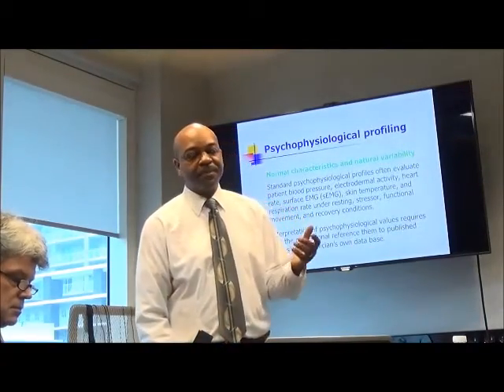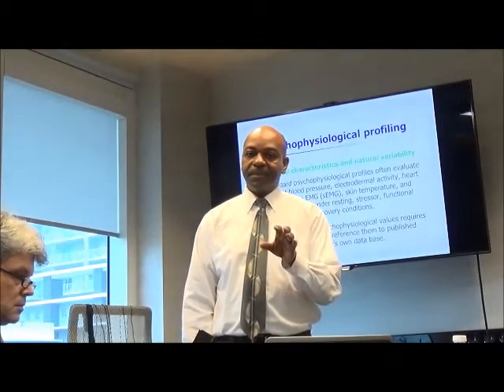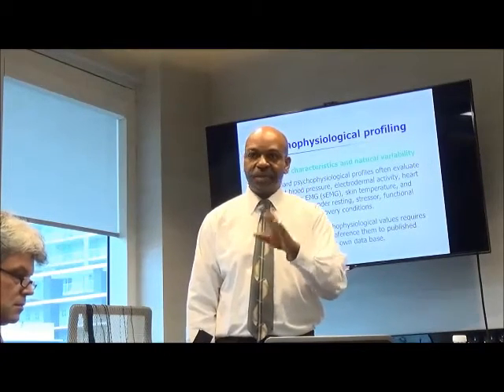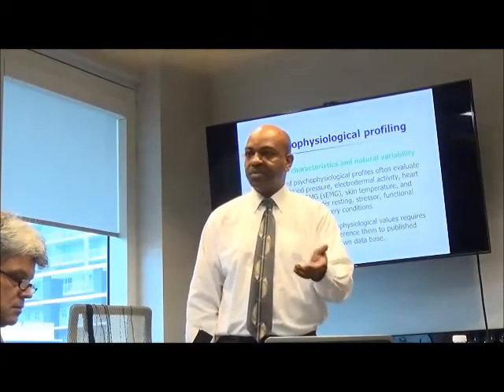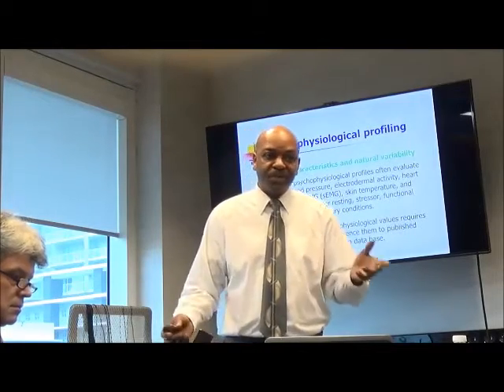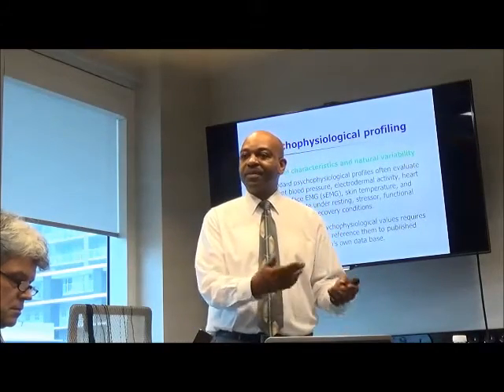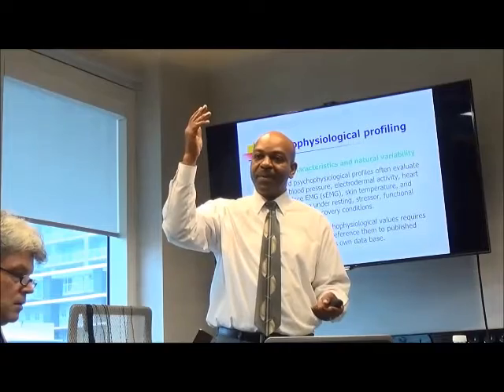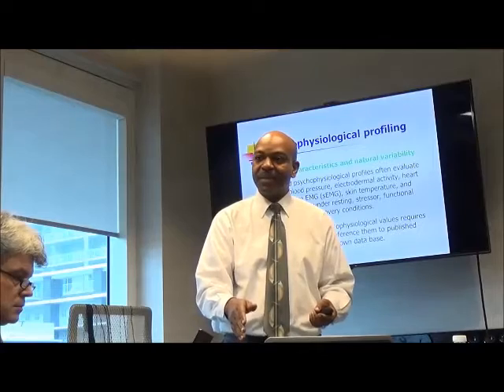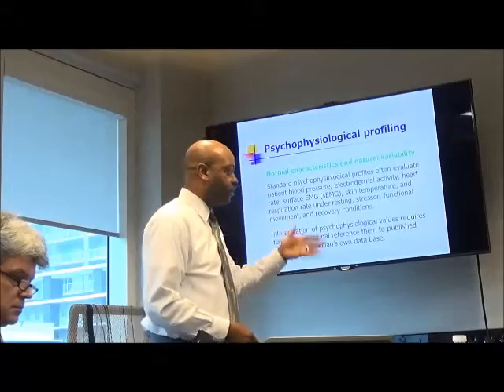And I've also seen where somebody does a baseline, just recording, not doing any stressors or anything, and they see, okay, the EMG is only 2 microvolts, so they have no problem with EMG, so they don't decide to use EMG with the person. But if you put the person under stress, the EMG goes up. And then when you say to relax after the stressor, it doesn't come back down to baseline. But if you just have them passively sitting, you would miss that altogether. So that's another reason why you do it in this way.